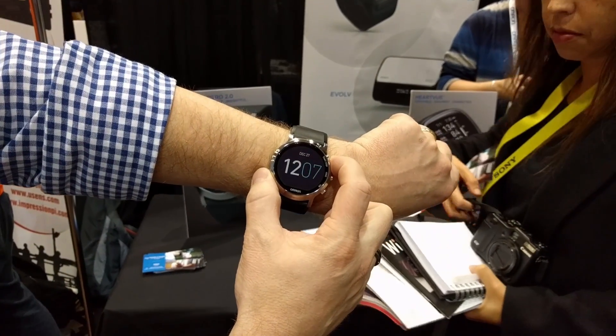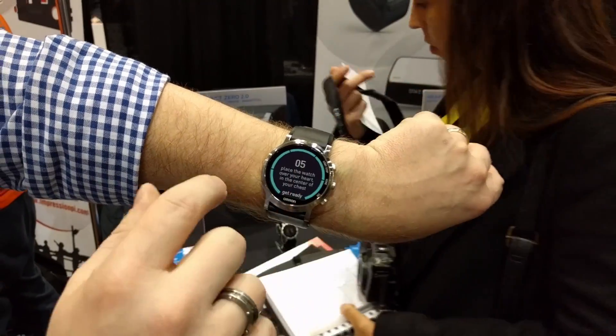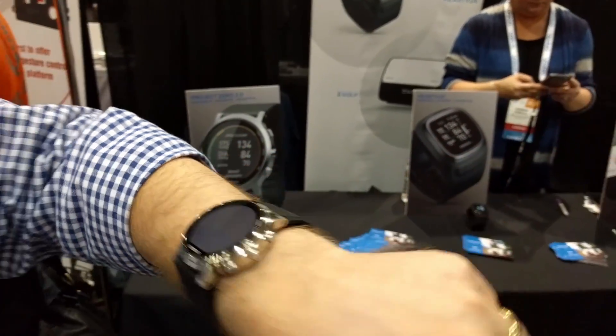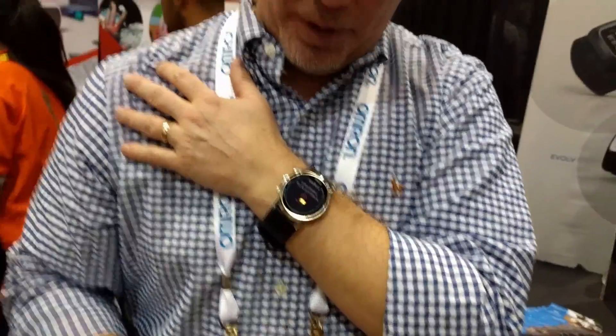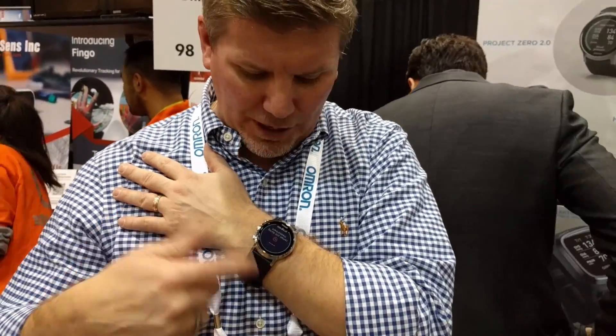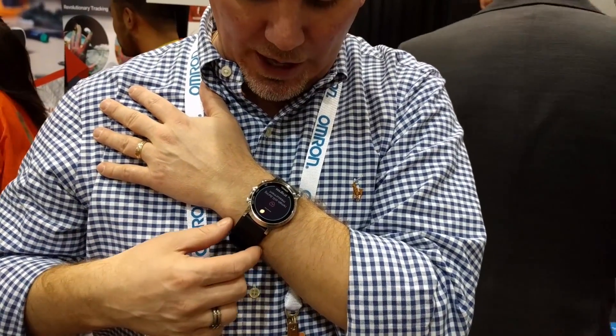To take my blood pressure, all I would do is press the start/stop button. It gives me five seconds to put my hand over my chest. If you're going to take your blood pressure, it always has to be done at heart level. I can see it beginning to inflate, and I can feel the pressure starting to take my blood pressure.